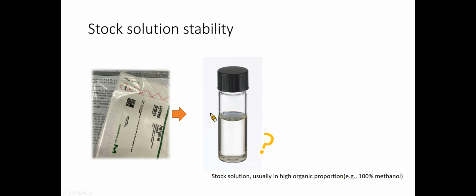A stock solution refers to an analyte in a solvent or mixture of solvents at a known concentration, which is used to prepare calibrators or QC samples. Stock solutions should not be made from reference materials that are about to expire unless the purity of the analyte in the stock solution is re-established.